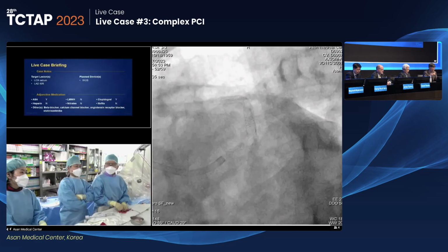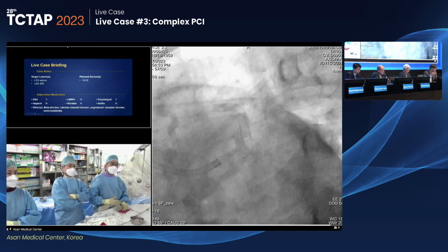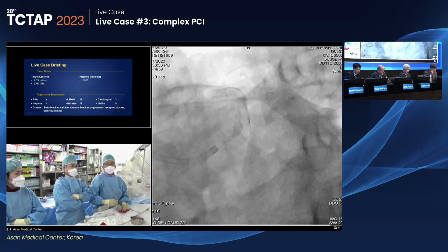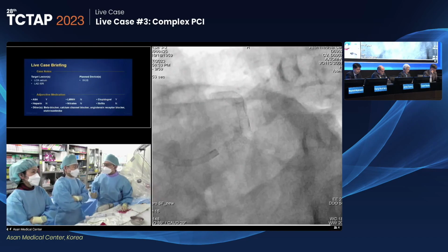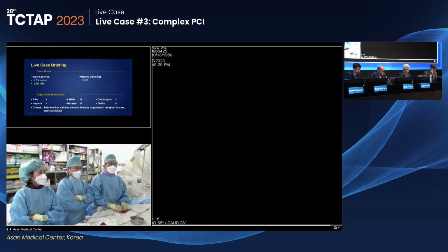Thank you for the presentation. In summary, the 64-year-old male patient underwent left main to LAD stenting 4 years ago. It was a very calcified lesion. We did the rotational atherectomy. And at that time, I was with him. He was my fellow at the time. So I called him back. After 4 years, with the thallium SPECT abnormality, he went back to coronary angiography.